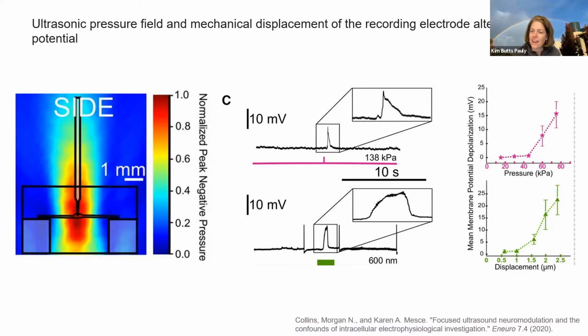I think so, but I'm a little confused. Aren't you saying that if you move your device by just a little bit, on the order of the radiation force, you're going to get the same sort of deflection? Isn't this sort of saying that the mechanical force has the same response as the ultrasound? It is, yeah. You might make the argument that moving the needle itself is affecting the membrane and delivering mechanical force to it. But I guess they were making the point that it wasn't ultrasound per se, but more an artifact. But Kim, you're making a great point here.